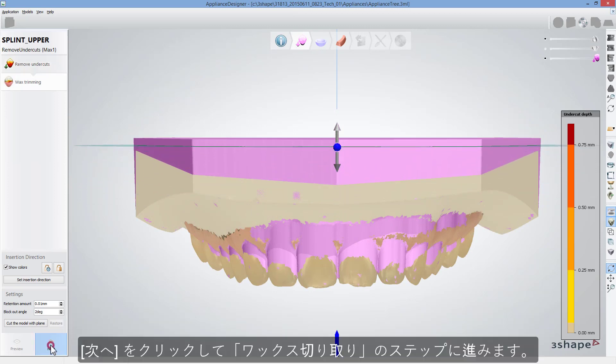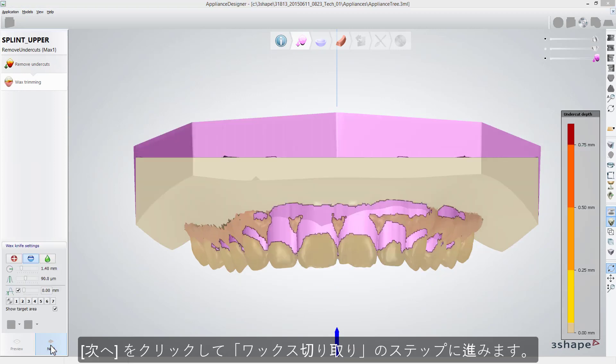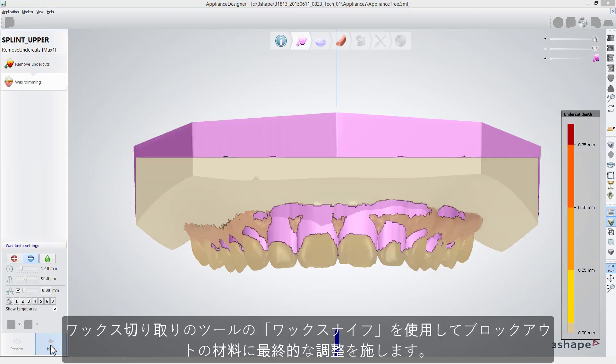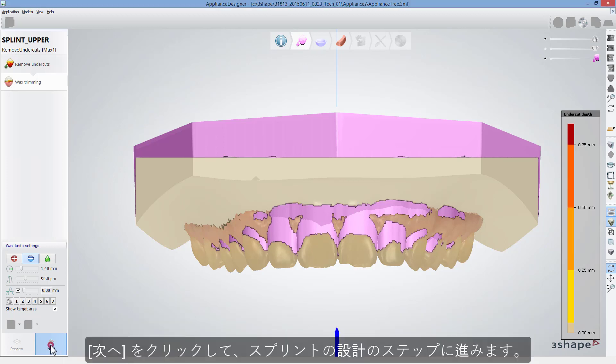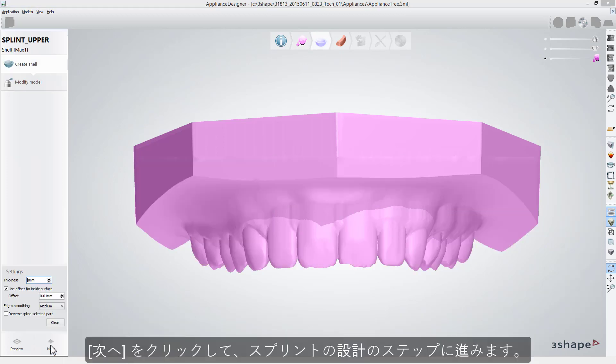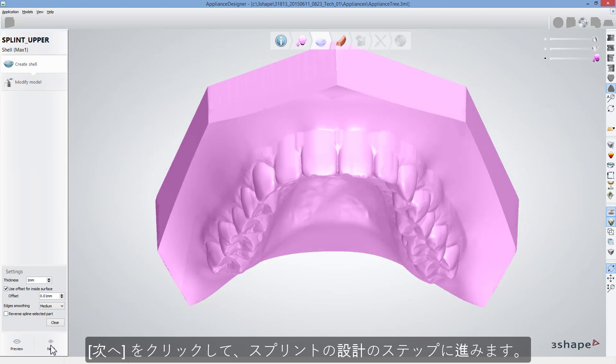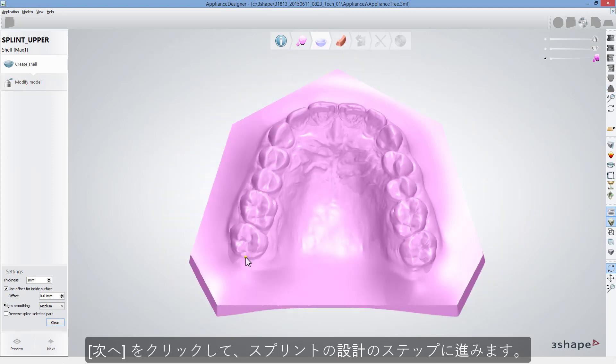Then click Next to get to the Wax trimming step, where you can do the final adjustments to the blocking out material using wax knife. Click Next again to get to the Splint shell design step.